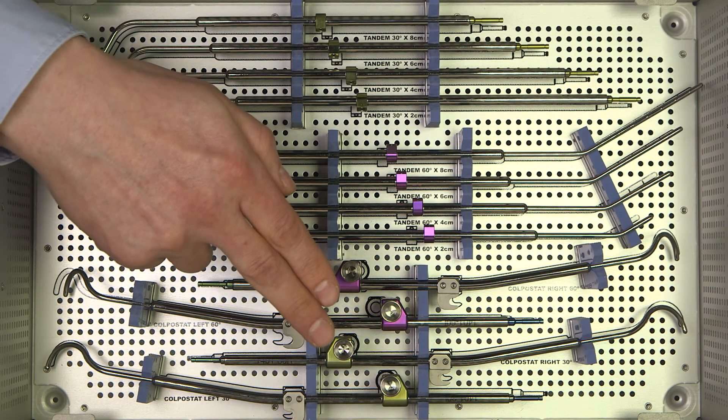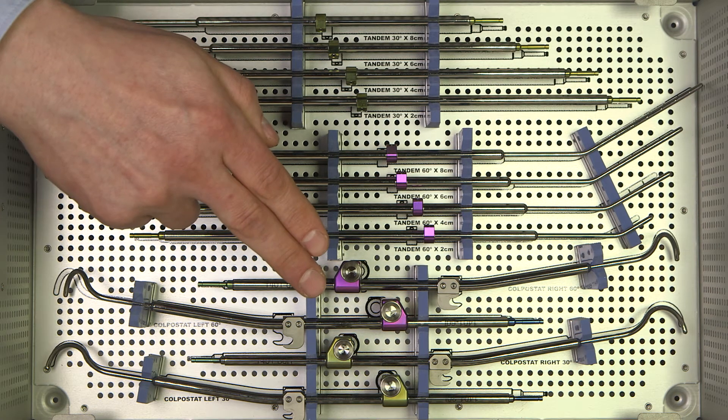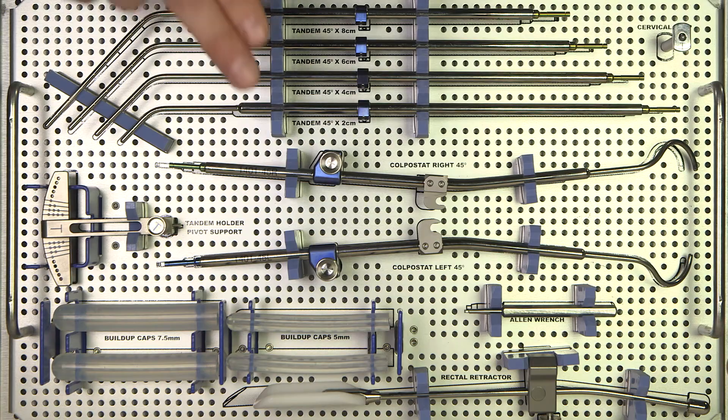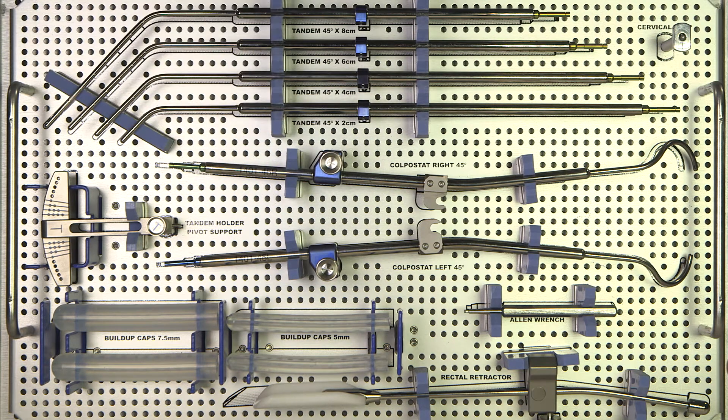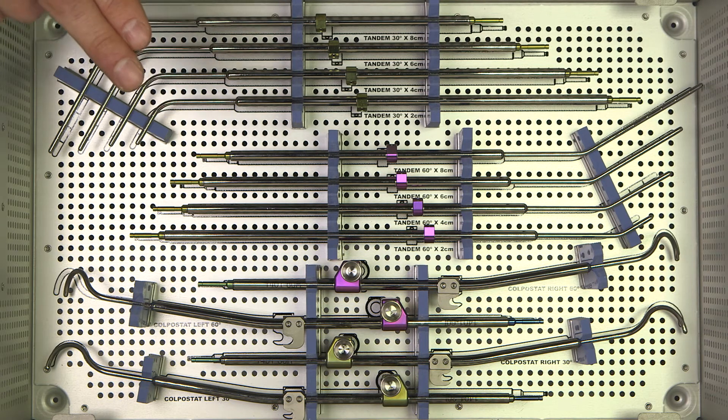Gold for the 30 degree split ring, purple for the 60 degree split ring, blue for the 45 degree split ring. The U-tubes are available in different lengths: 2, 4, 6 and 8 cm.